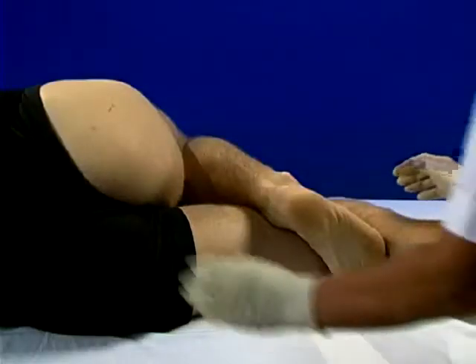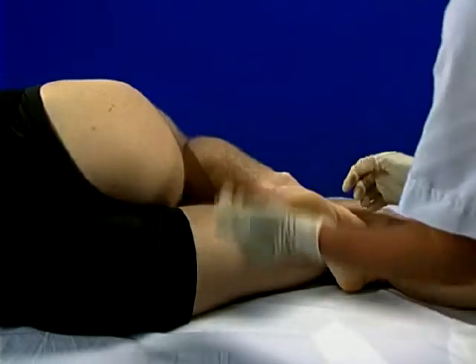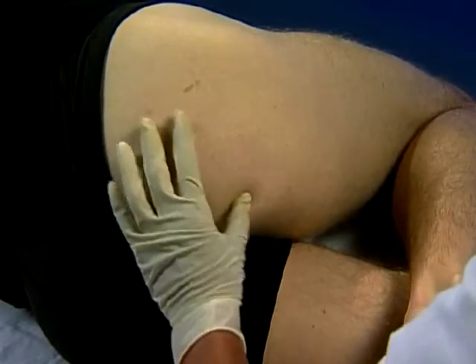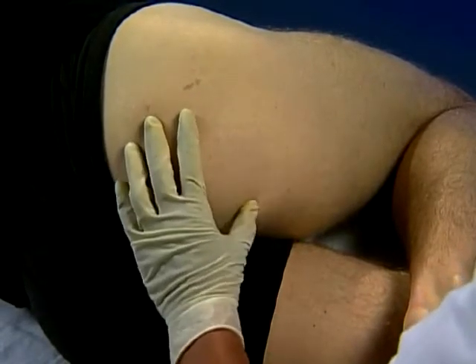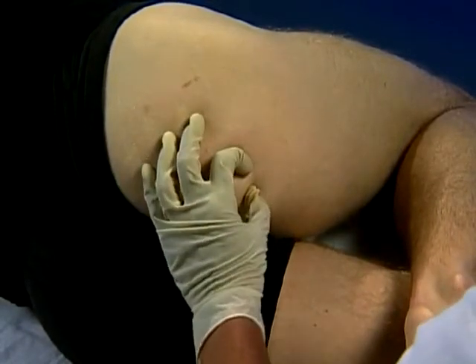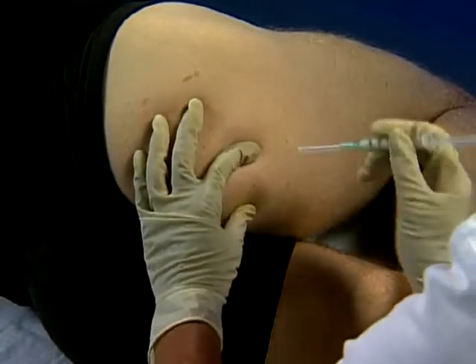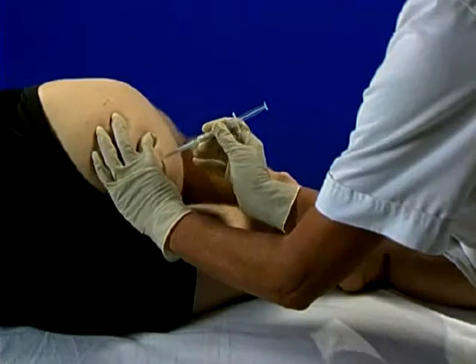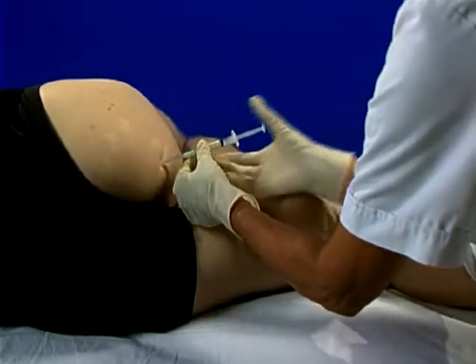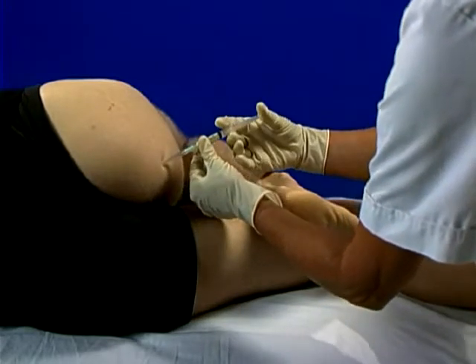The patient lies on the unaffected side with lower leg extended and upper leg flexed. Identify ischial tuberosity and immediately distally palpate the wide band of the origin of the hamstring tendons. Mark entry point here, clean and firmly stretch skin, and rapidly insert needle perpendicularly. Angle upwards to gently touch bone. Aspirate and pepper into the enthesis or inject ischial bursa as a bolus.